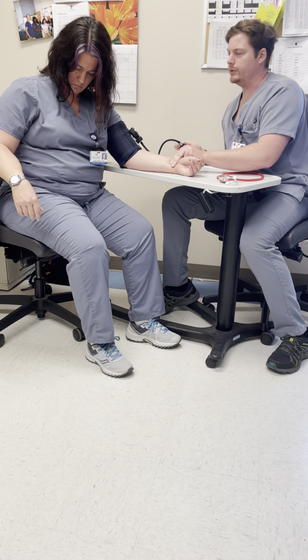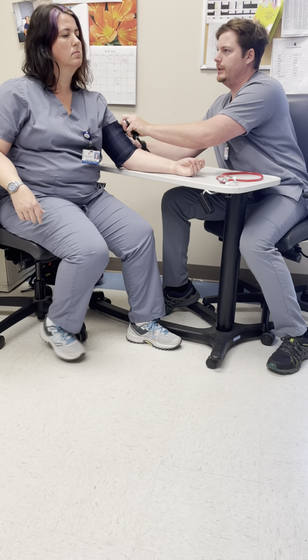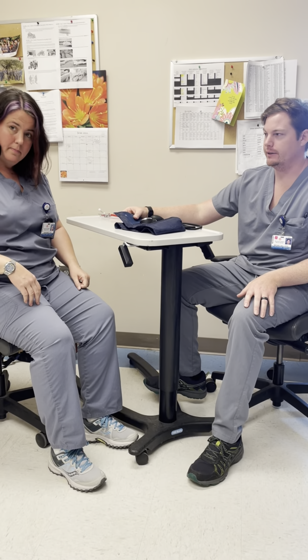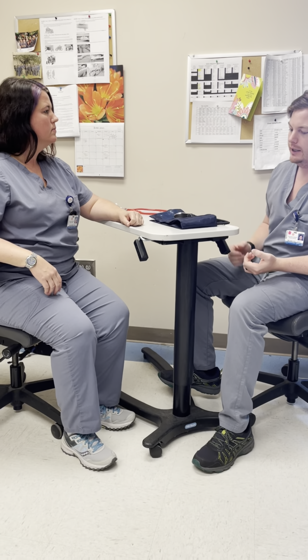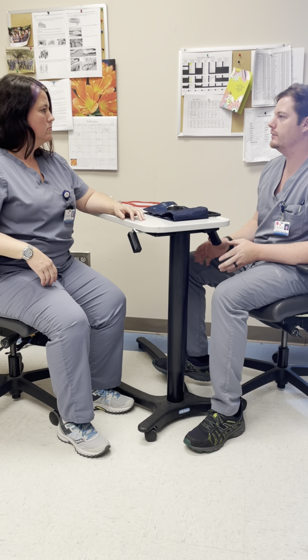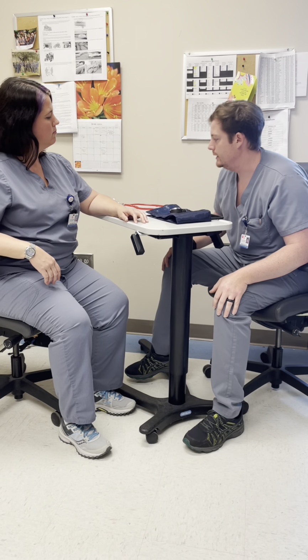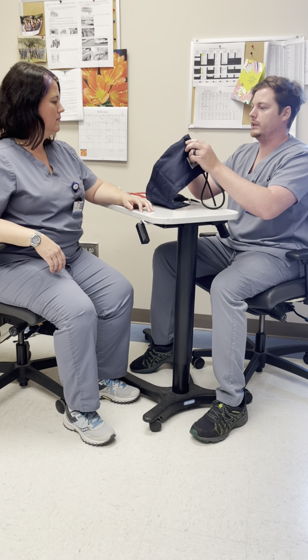Your occlusion point was at 130. So we're going to give you 1 minute of rest before we take your blood pressure. All right. A minute has passed. So the next thing we're going to do is check your blood pressure. We try not to talk as much so I can hear a little bit better. We're going to make sure our feet are flat on the floor, and we don't cross our legs either. And then after I finish this, I'm going to clean this stuff up for the next patient that I see.